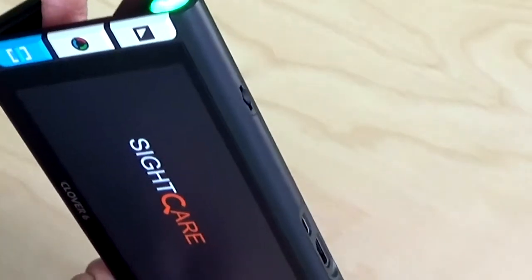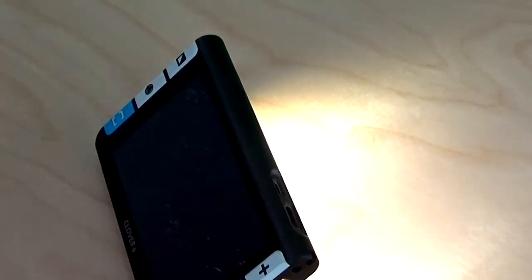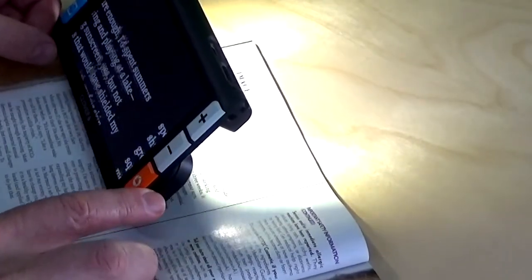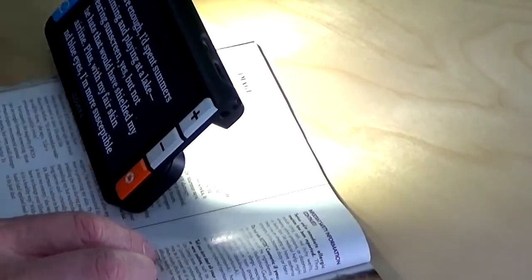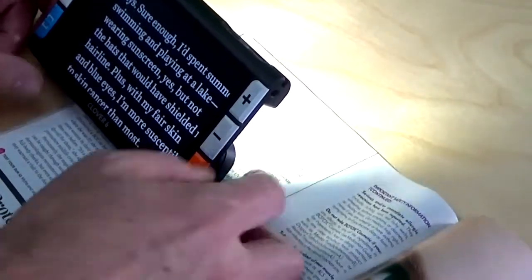Let's turn it on and see how it works. I'm going to press the power button for about a second and hold that down — it fires right up. Grab some reading material. It's real easy, just put it on there. We have a center camera and it's very easy to locate what you're trying to read.